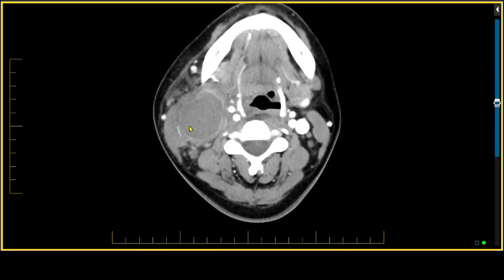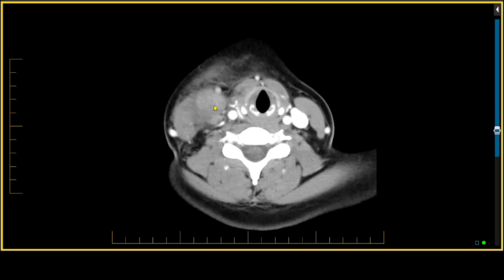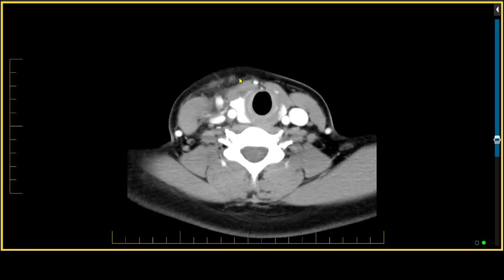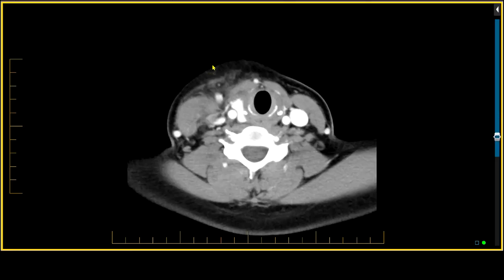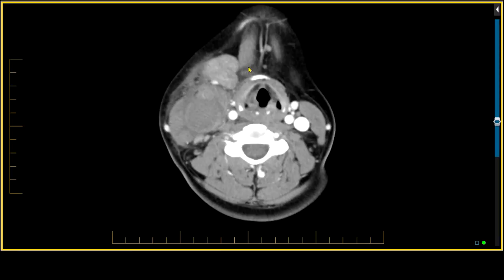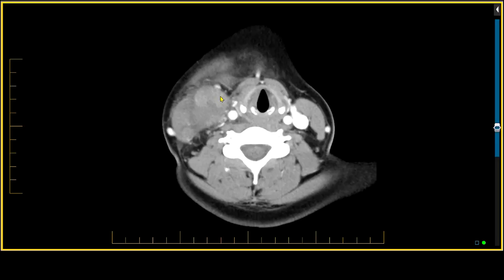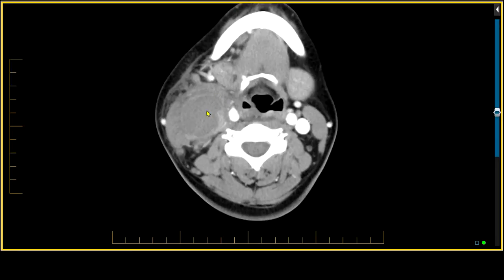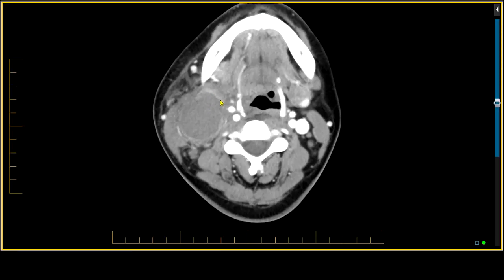The lesion has cystic components as well as solid components, and not only that, but we see subcutaneous spread into the platysma muscle on the right side as well as the subcutaneous fat. This very large lesion with irregular borders, spread to the platysma muscle, and spread into the subcutaneous fat is one that we would suggest represents a malignancy, even though it does have some cystic component.